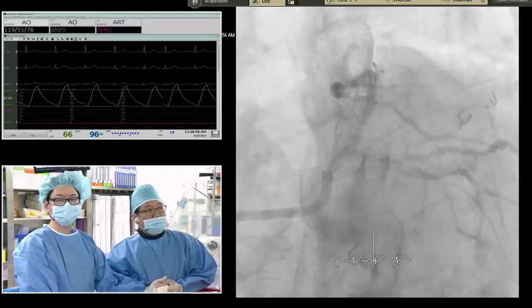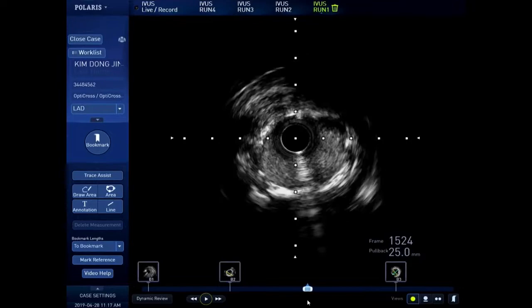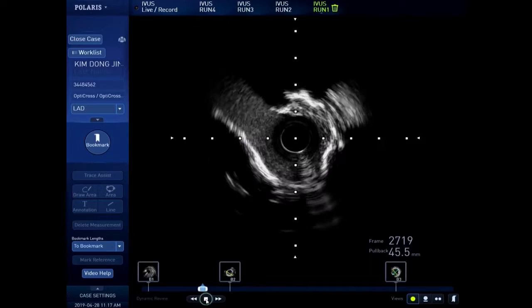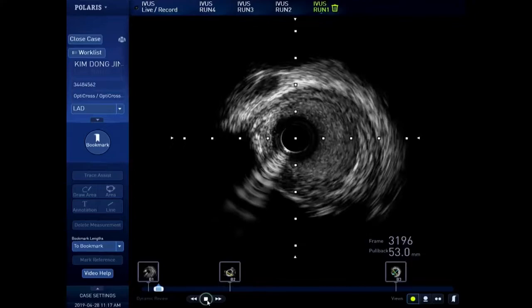Yes, you can see the LAD IVUS. Ron, please show us the IVUS. Please skip just above, focus on the left main. Okay, here is the just stented area. Ron, please, from here. This is the stent proximal portion. The stent is a little bit underexpanded compared to vessel size. Here is a proximal LAD, very calcified, superficial calcification more than 180. Vessel size is 4.0. Not so significant stenosis, but plaque burden is more than 50%. Here is the LAD ostium. Here is the left main.